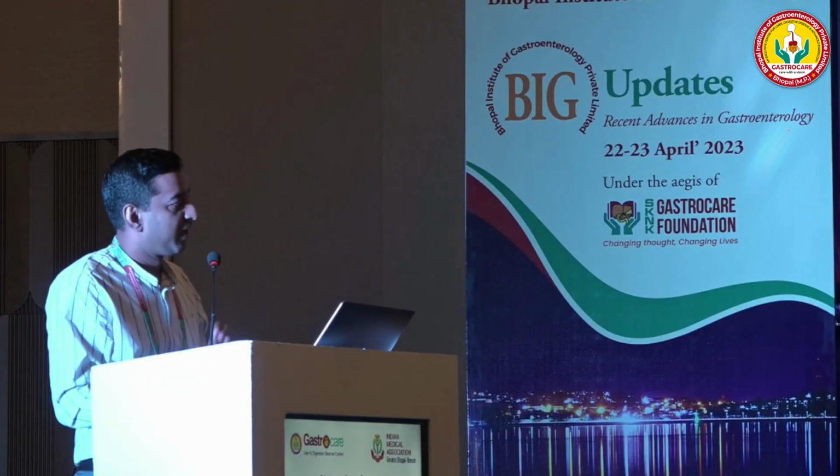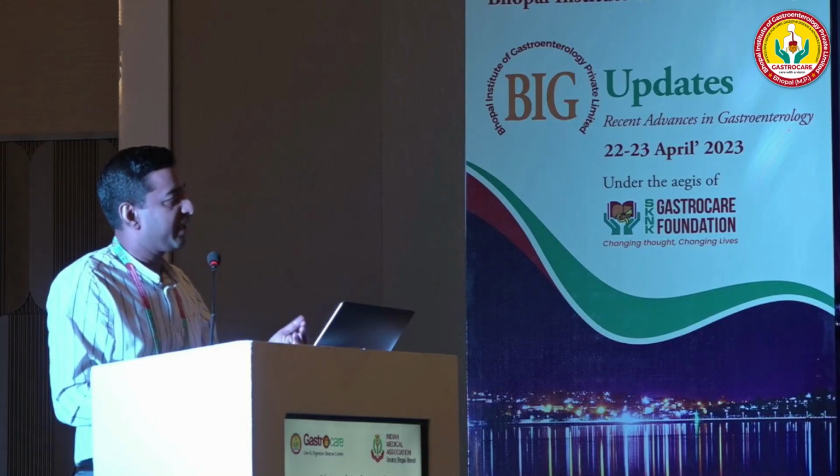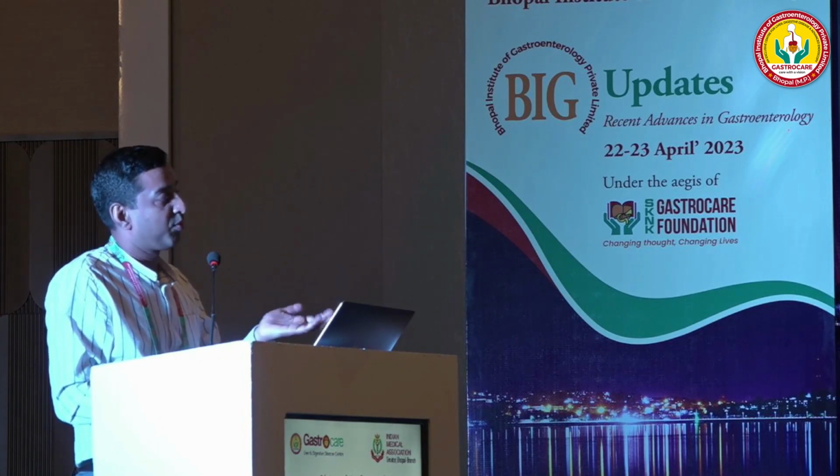It is as linear as possible. We don't want to go in a tortuous path, and we want to make sure that right now we are draining it, but in future if the patient doesn't improve, he might need necrosectomy. Maybe. So we are always prepared for that. Right. And for that we need to dilate the tract up to 30 French.